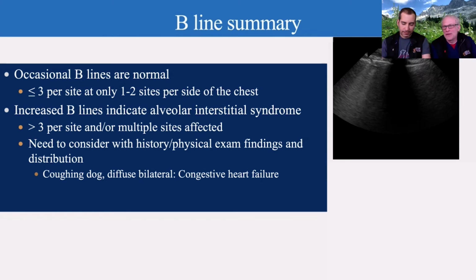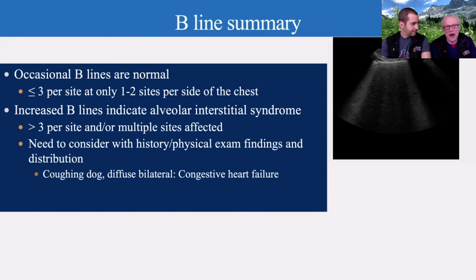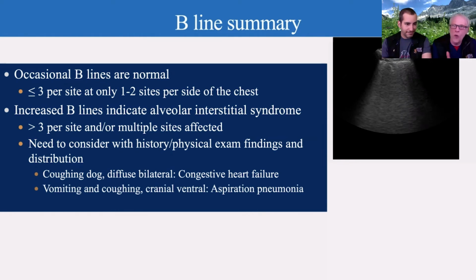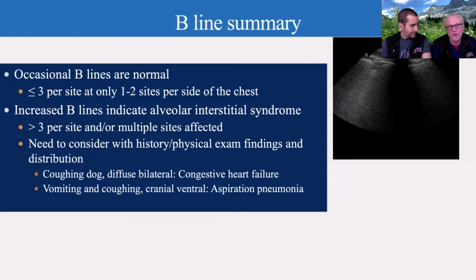You bet. We don't have time to do that in the hour. It usually takes us about 7 hours to get through all of the point-of-care ultrasound that we want to talk about. But you can absolutely assess the heart as well. Nicely done, Dr. Chalhoub. All within about a minute and a half, and we can say, well, this is congestive heart failure.